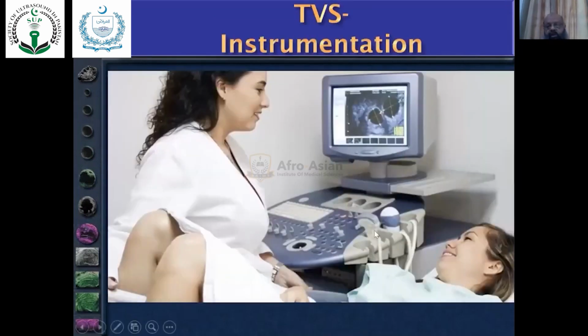We can use the same machine for 3D, 4D volumetry. We can use it for abdominal with the convex, and even if we need it for musculoskeletal or for small parts, we can use the linear transducer. So the difference is in the settings for TVS and the transducer.